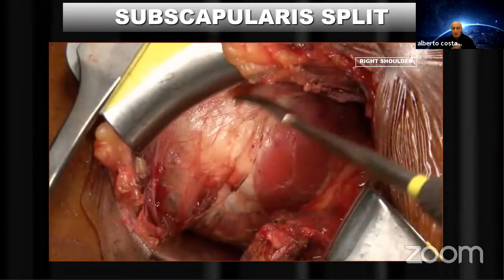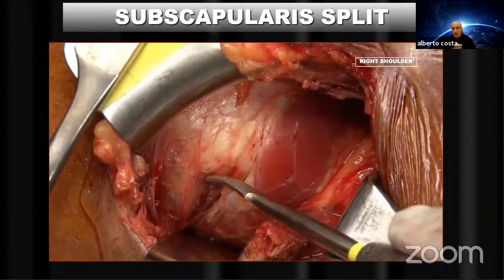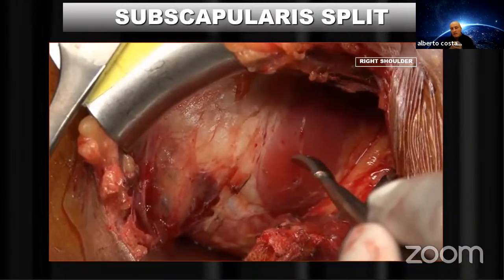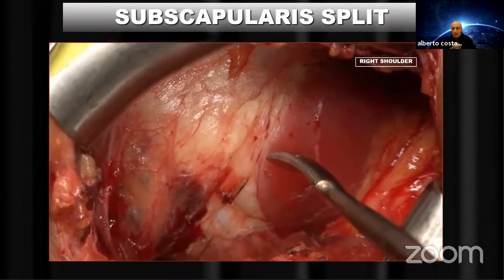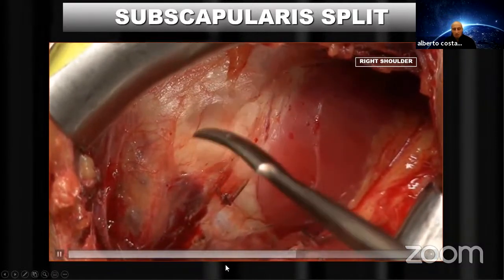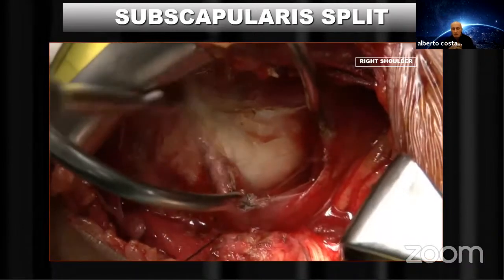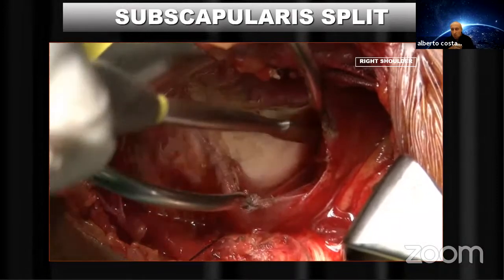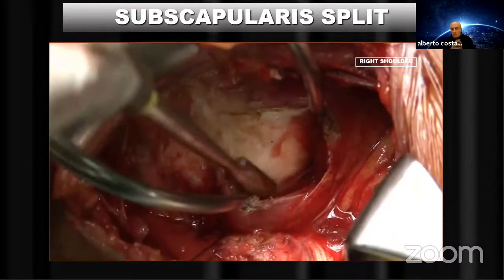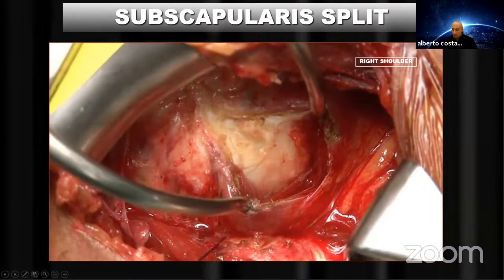what we do. This is the subscapularis. We put the arm in external rotation, so we have part of the tendon and part of the muscle, and we choose the inferior third. You see down here the three sisters, so we are a little bit higher than the three sisters, and then with the Gelpi retractor, once we have done the little split with the scissors or the forceps, we have the capsule just beneath our Gelpi.